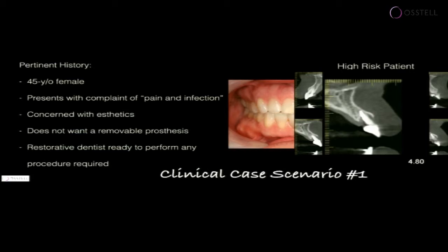And we can also tend to see that the bone within the alveolus is not homogeneous. And so therefore there's areas of more dense bone and less dense bone. And so if we have the ability to have a cross-sectional image and a three-dimensional assessment, we can understand that we can redirect the implant so that it will be placed within the most volume of bone and actually engage perhaps some of the more dense bone, rather than if we did this blindly with a periapical x-ray, which would tell us that we had plenty of bone, and then if we followed the extraction socket, we may be completely out into the vestibule. And so obviously the position of that implant is going to be very, very important in terms of whether or not it's going to have initial stability.